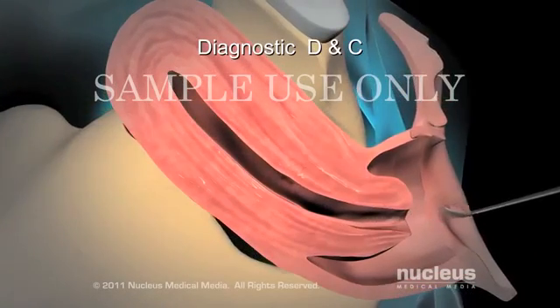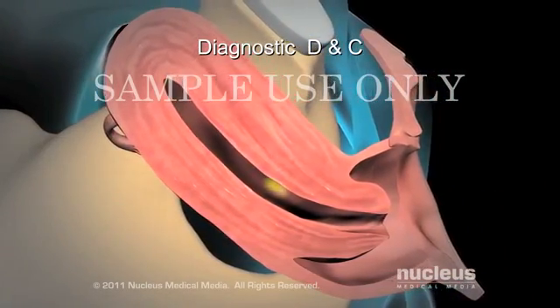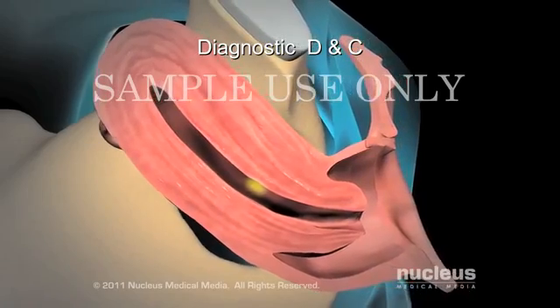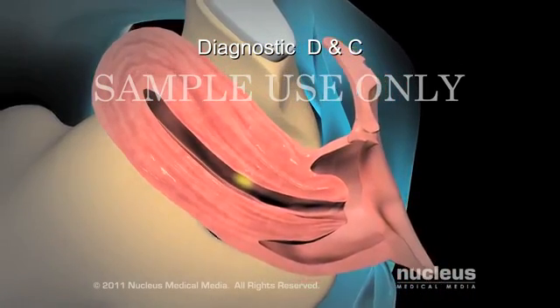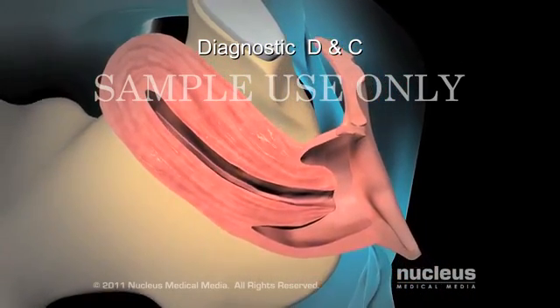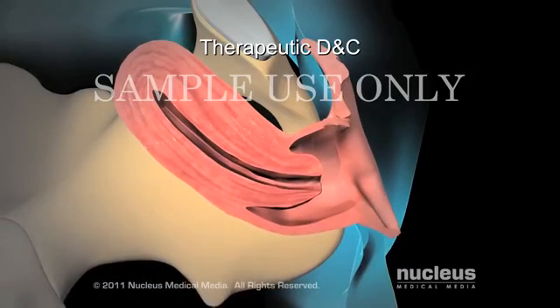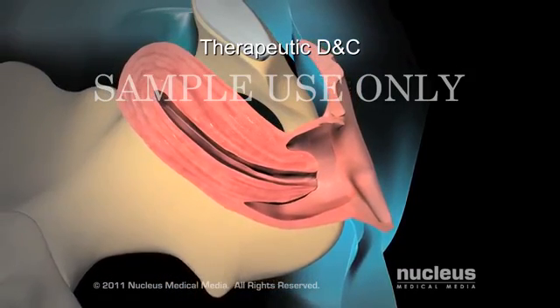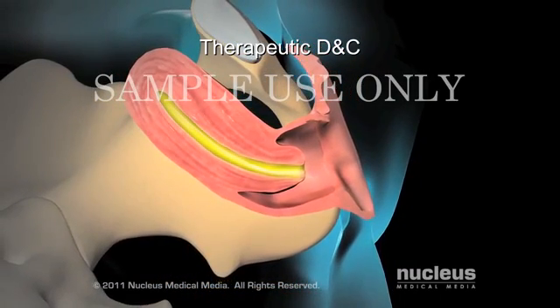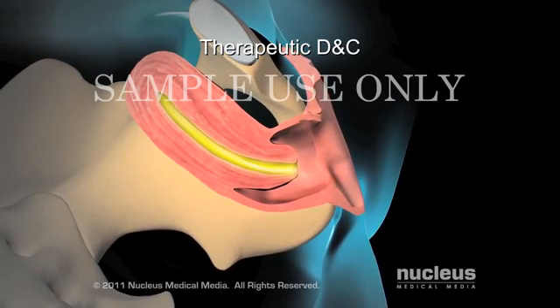If you are having a diagnostic D&C, your doctor will remove only a small sample of the endometrium and send it to a lab to test for various conditions. If you are having a therapeutic D&C, your doctor will remove the entire contents of the uterus to treat a known uterine condition.